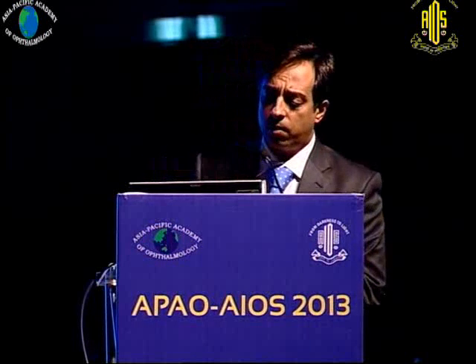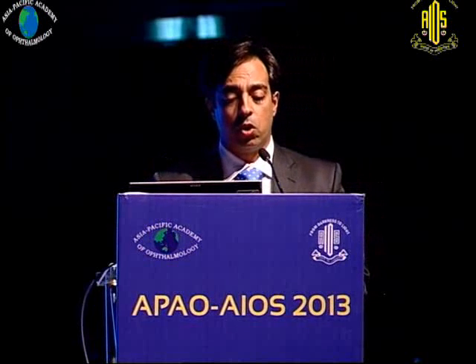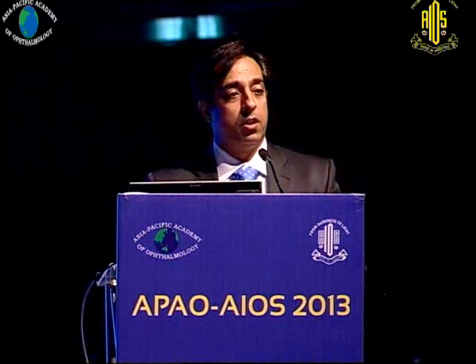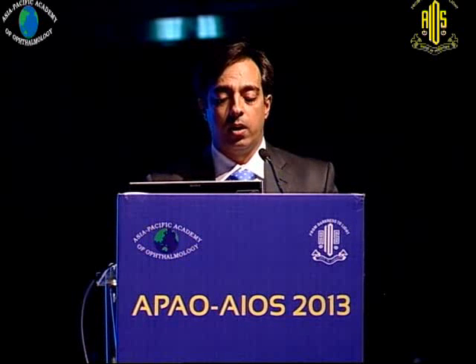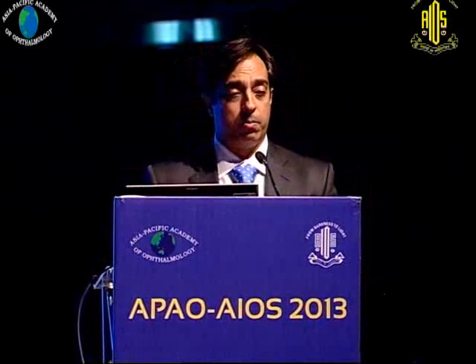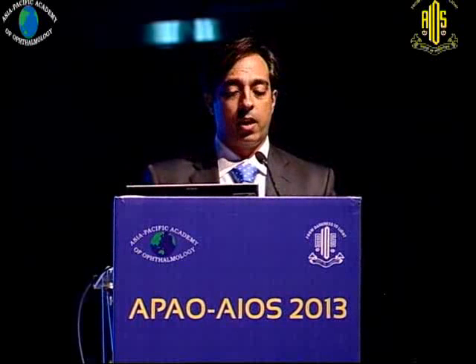Now we all know that in some of these vascular situations over time the vitreous tends to split and has two components. So here what you're seeing is a whole component of vitreous coming off, and in spite of it moving, the blood is still trapped, and one gets confused at times that you feel that the hyaloid is already removed from there, and why is the blood not coming off? But that's because you probably removed a small cortical portion of the posterior attachment, and the main chunk is still behind. So you will find these variations in different cases, and every case will not have exactly the same way the hyaloid would come off.